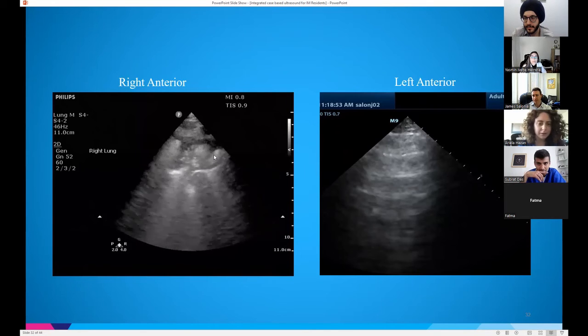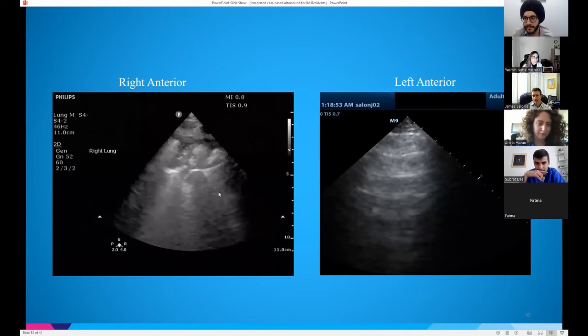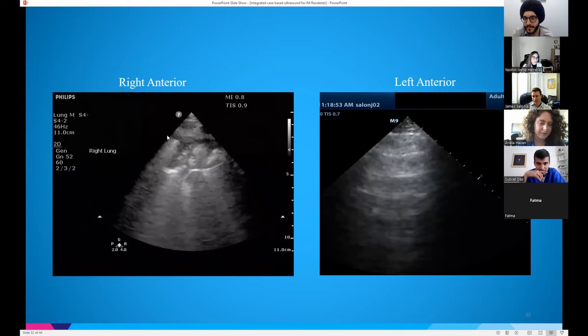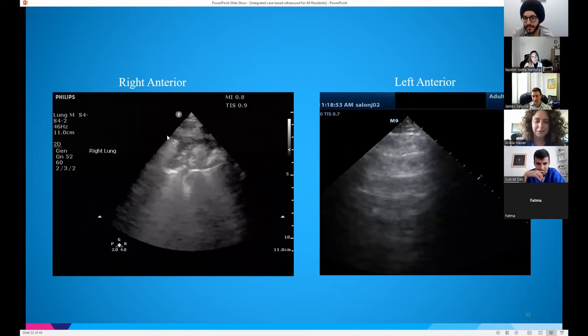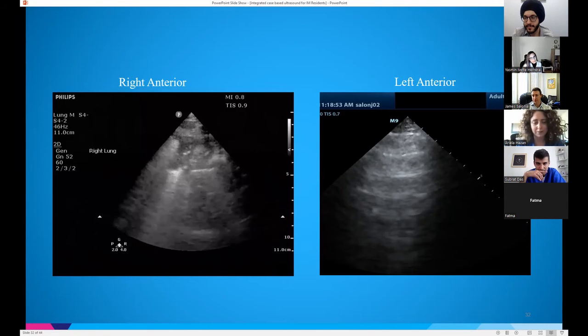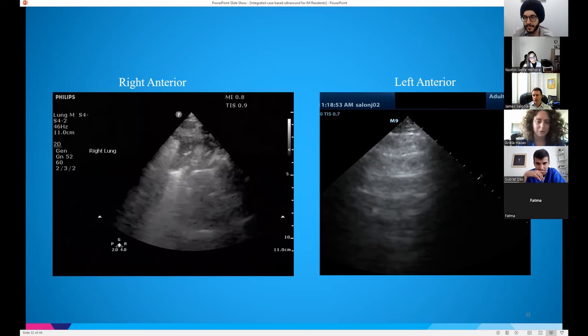It's very irregular looking. It's actually kind of hard to see where the pleura is, or if it's below or above, I mean, anterior or posterior to that irregularity. And it's also immobile looking. So I don't know, maybe you could consider more like a mass or something that's fixed to the chest wall.